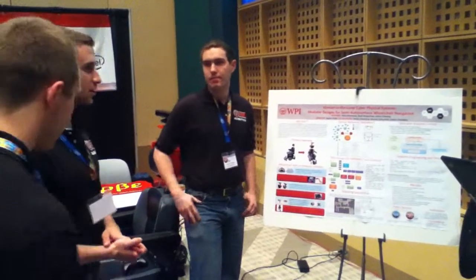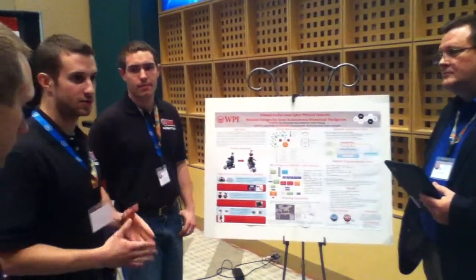Part of the motivation for this project was that some physical and mental disabilities are coupled, so those people are not able to use conventional, regular powered wheelchairs, for example, because of falling downstairs or things like that. So we wanted to remedy that situation with a cheaper sensor package.